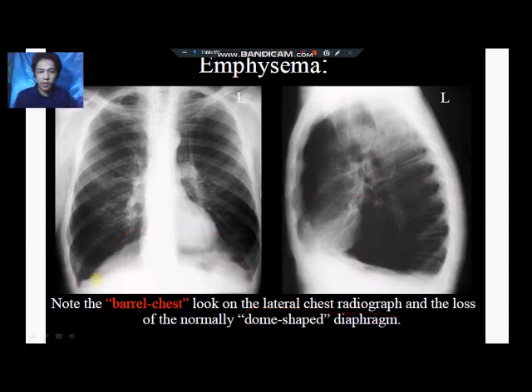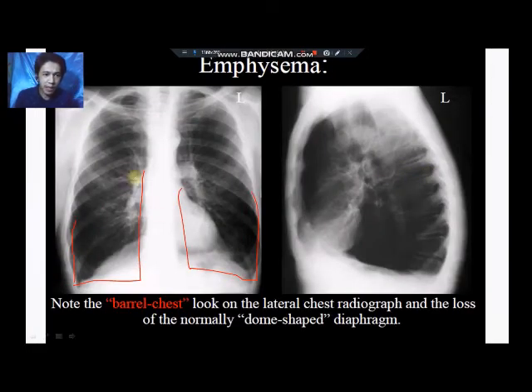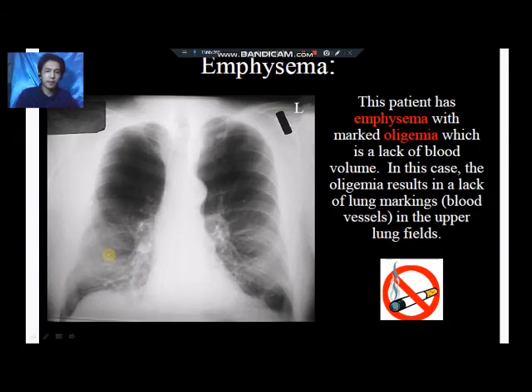That's why in some patients, if you get an x-ray, their lungs look rather flat. The lung fields are flattened. Also, if the patient has bronchitis, there is an increase in the opacity of the bronchial linings. This is why they are called COPD. When one is present, the other is also present: chronic bronchitis along with emphysema.